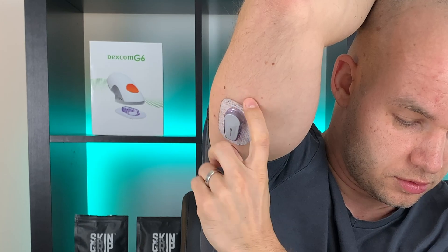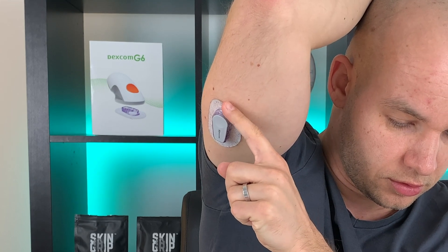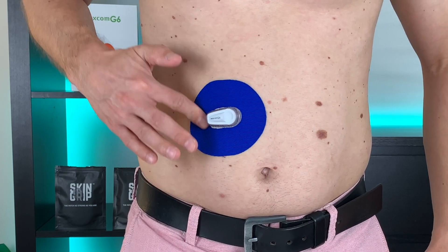There is one thing that bothers a lot of Dexcom users. The adhesive usually starts peeling off just a few days after we apply the sensor, and this has to stop. I'm going to share with you 7 tips that helped me make my Dexcom G6 stick really well for the full 10 days. Let's go!